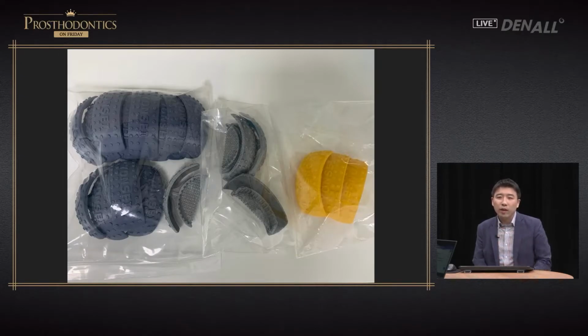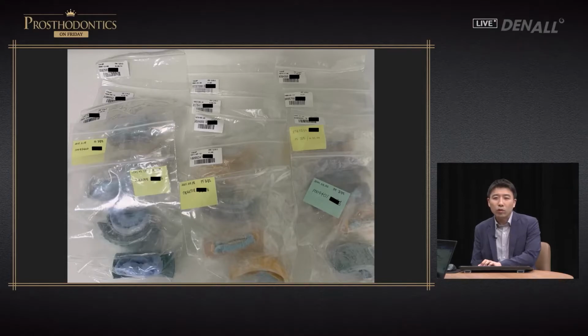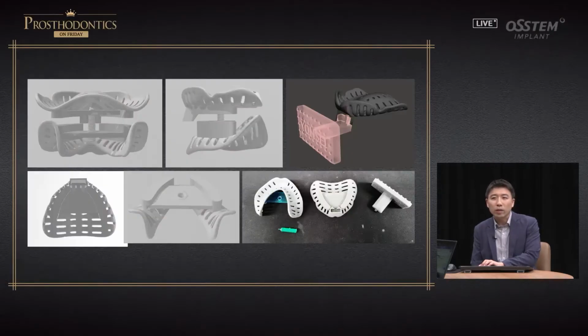We print out the jig with 3D printing. We have a lot of stock. When the patient comes in, we use it immediately. In the case of the jig for facial scan, up until case completion, you continue to keep it, and if necessary, you continue to utilize it. That's how I maintain these.